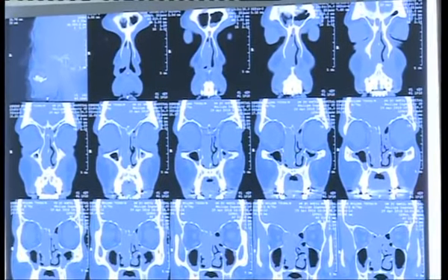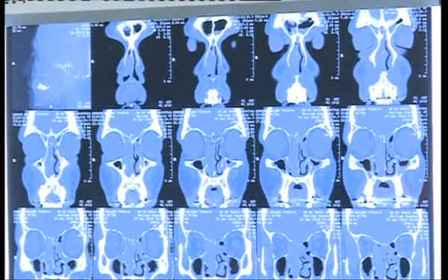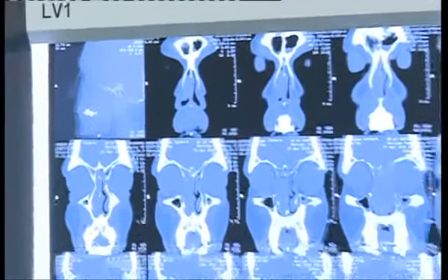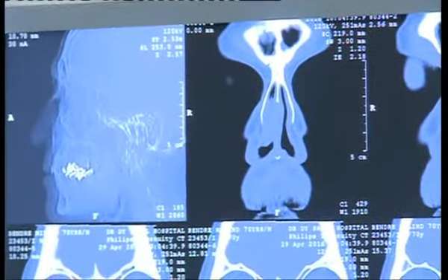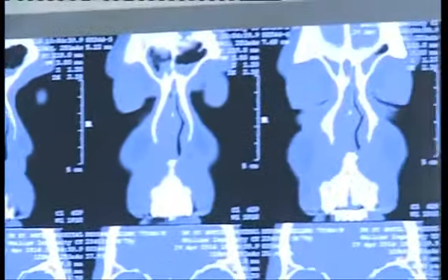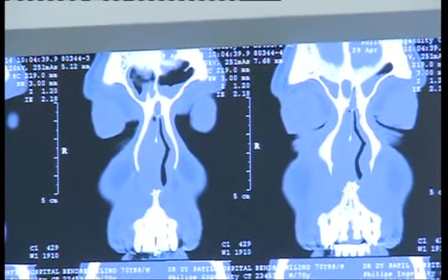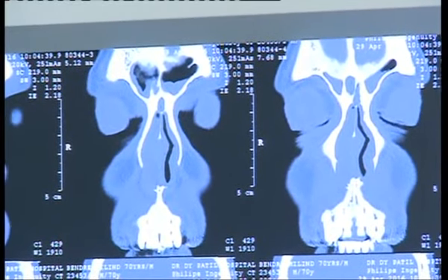And if you look at this very carefully, you can see that. Can you zoom into this picture? This picture? This one? Not that. Just come down, please. Second row, please. Yeah, thank you. Yeah, so stop.